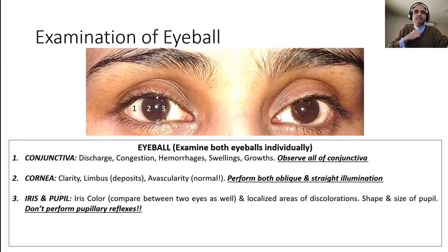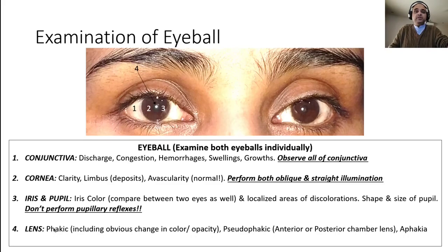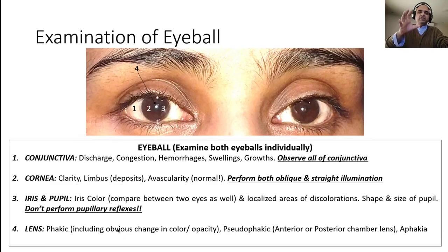Pupillary reflexes are not performed during this examination. Observe the iris for uniformity of color, especially between the two eyes, as certain diseases can cause the iris color to change between eyes. Also note slight normal variations in color. Check the color of the iris in one eye to see if it is uniform everywhere, then compare with the other eye. Then look at the shape and size of the pupil — is it round? On torch examination the pupil is normally two to four millimeters, unless dilated by drugs or trauma.